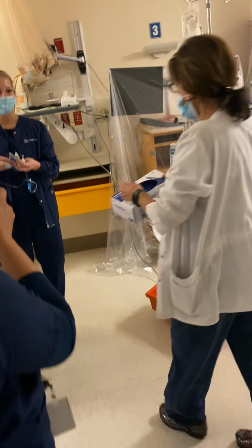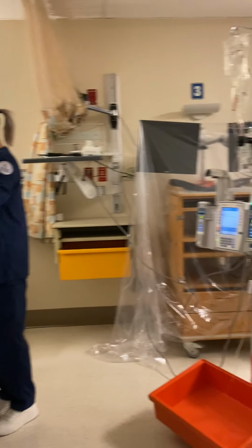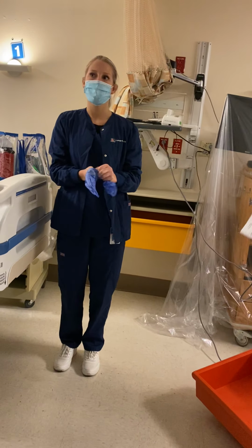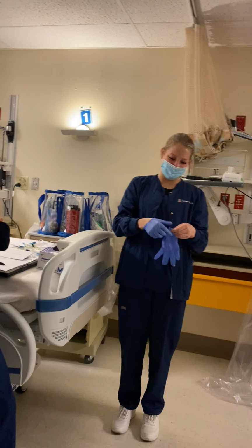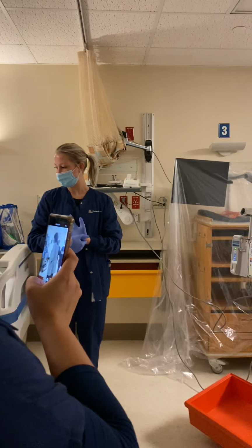Okay, so again, you would wash your hands and then put on your gloves as you're walking into the patient's room. There would actually be a table here. I wish I didn't really pull that table out.